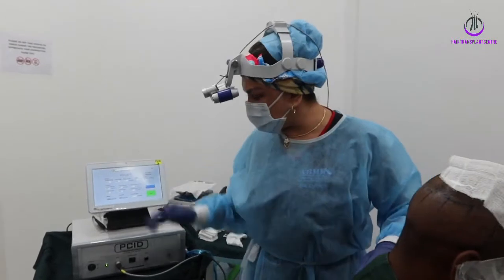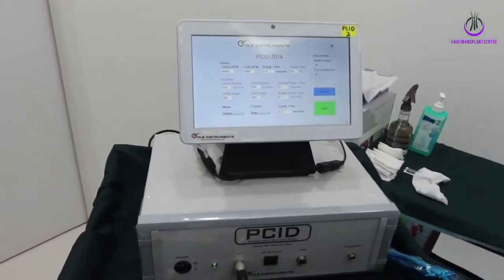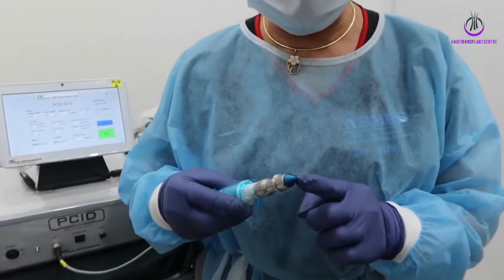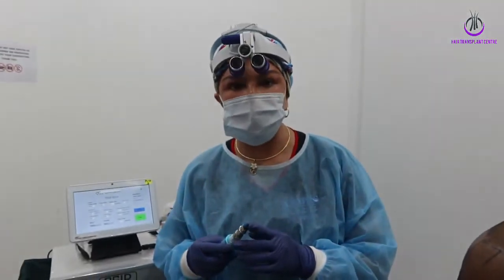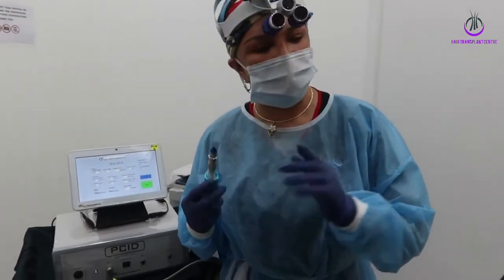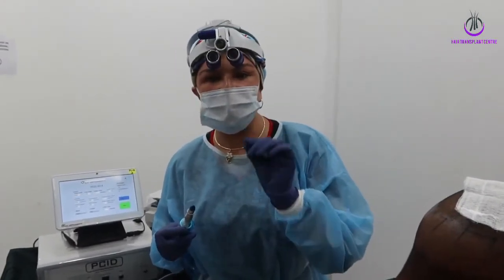So this is the machine. You can set the settings how you want them, and there is a graft count there. Later as I work, the machine will give me the graft count. And this is the handle, where the punch goes in. I'm going to use 0.8 mm today because his hair caliber is slightly thick, but maybe later I will use 0.75 mm at both of the temporal areas because the hair is slightly finer there.